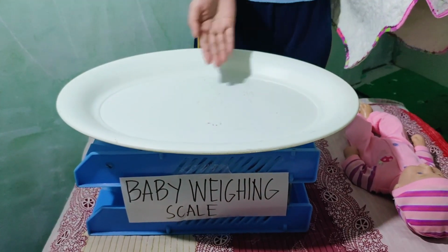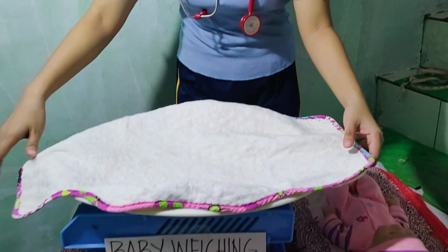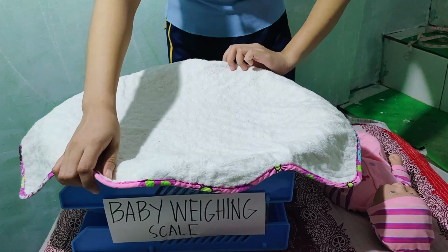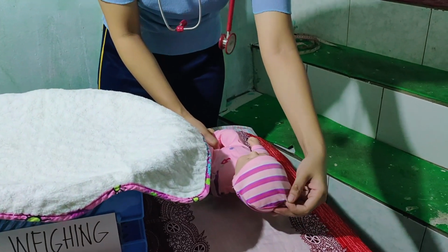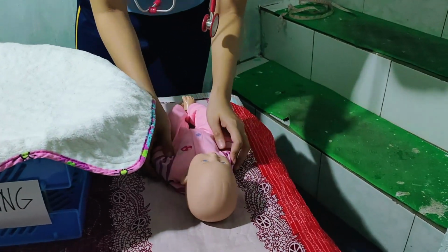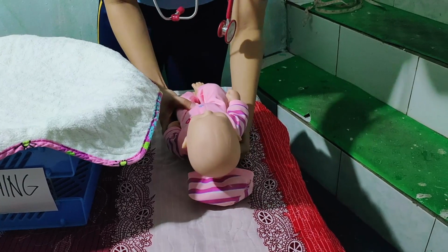Lastly, we will measure the weight of the baby. We will use a baby weighing scale. We need to cover it with a blanket. The baby must be naked, so we will remove all the clothes of the baby so we will have accurate measurements.